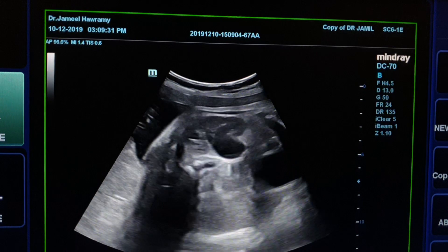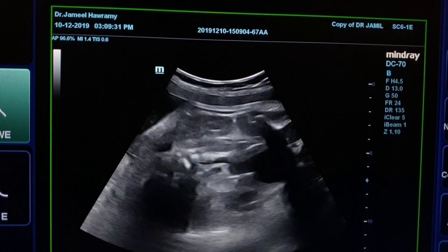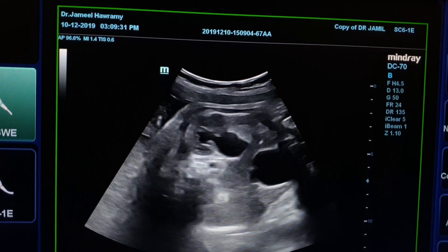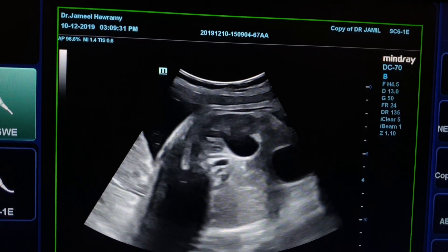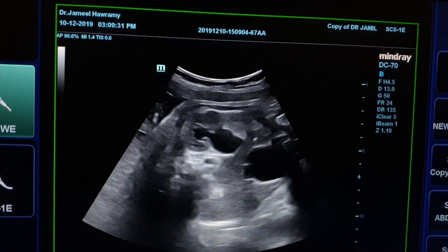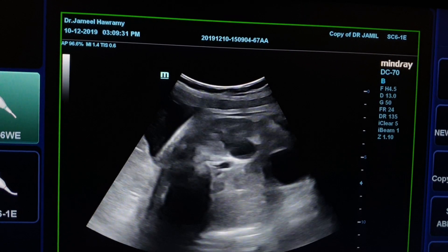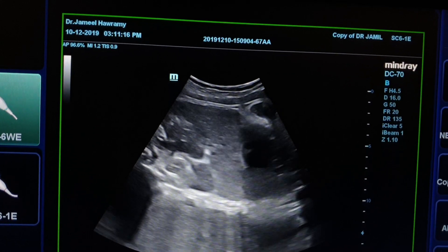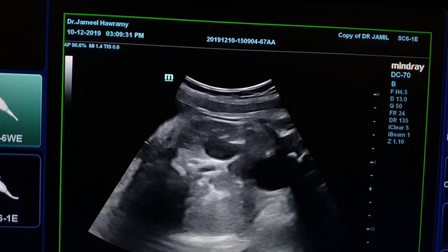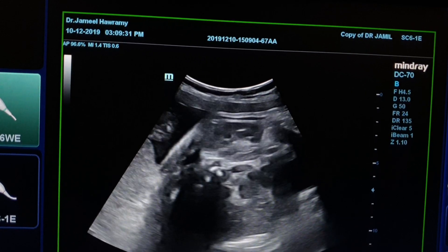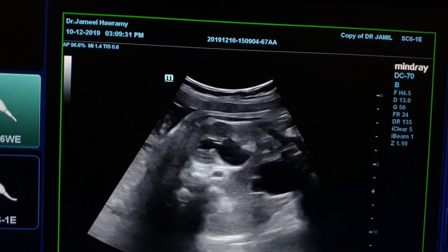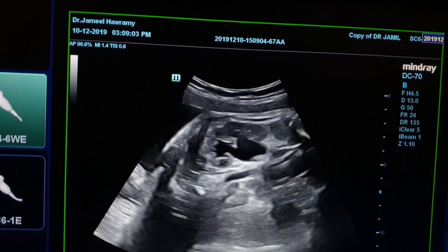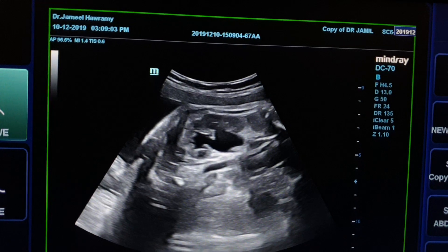Longitudinal section of the hydronephrotic left kidney showing abrupt change in the pelvi-ureteric junction (PUJ) area, no ureteric dilatation — a picture of PUJ narrowing. Normal right and hydronephrotic left kidney in longitudinal section confirming abrupt change at the PUJ area with no ureteric dilatation, consistent with PUJ narrowing.